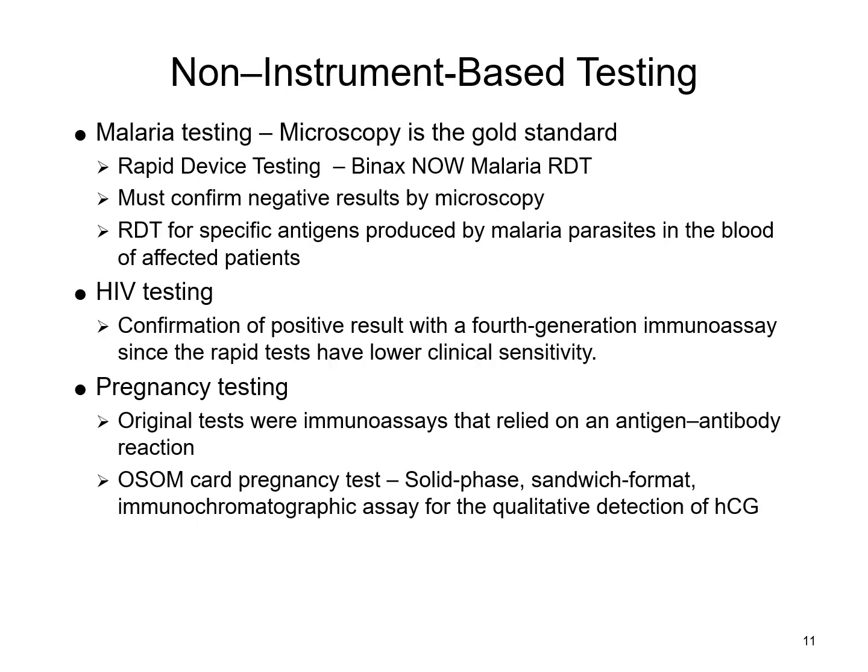Most point of care testing is done by a manual rapid type of method. Most tests that continue to be developed are basically for use in emergency departments, hospital settings, nursing homes, physician's offices, bedside type of things, and sometimes even home use.